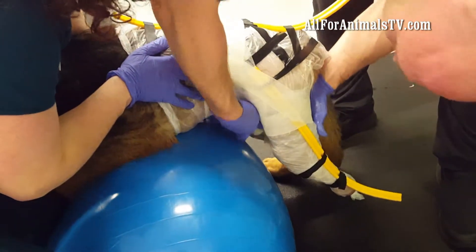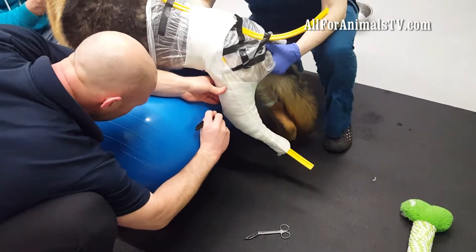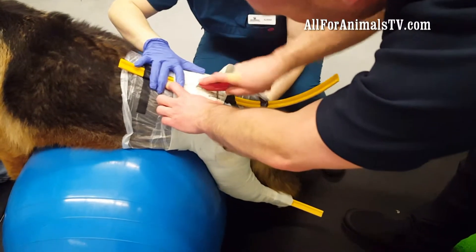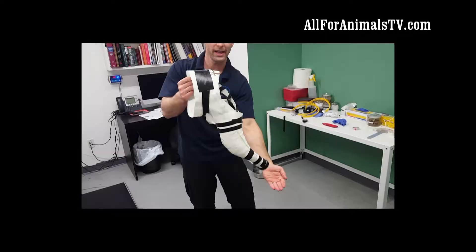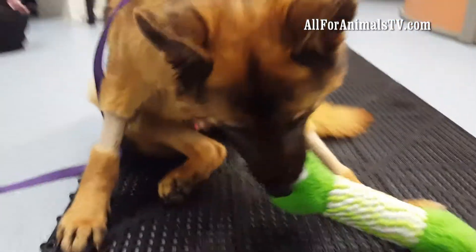Then we take this impression and mark his bony landmarks and the specific information that the prosthetic company Orthopets needs to create this device. We send this fiberglass impression to them and they have a very technologically advanced proprietary process where they do a computer scan, generate an image, and then use high-tech equipment to create a custom-made prosthetic, which they'll then send back to us.